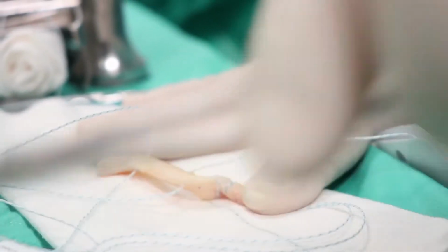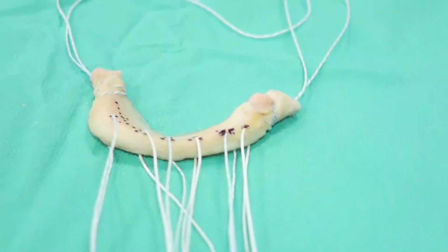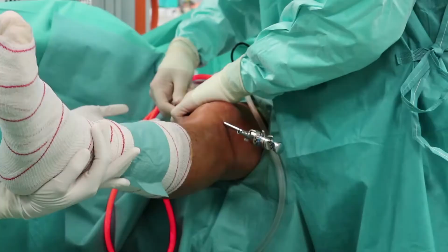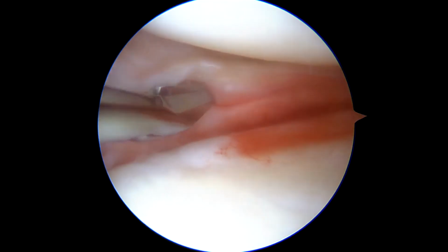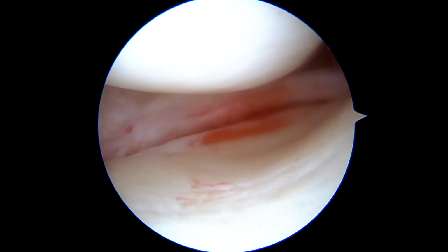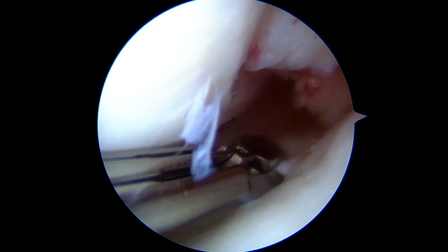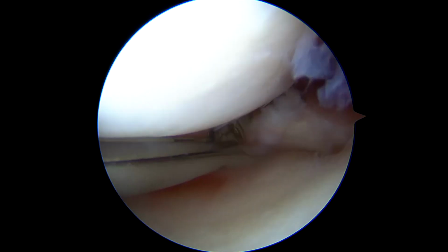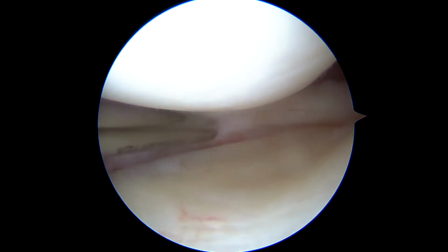At least 5 to 6 alternated colored sutures are preloaded in the body and anterior horn of the graft, and the two bone plugs, posterior and anterior, are preformed to an 8 and 7 mm diameter respectively and also secured with transosseous threads. Diagnostic arthroscopy and the preparation of a bleeding meniscal bed area are carefully performed without ischemia. The meniscus remnant is saved until the meniscocapsular zone red area is reached. Previous meniscal extrusion and integrity of the inferior meniscocapsular junction is also inspected at this point.